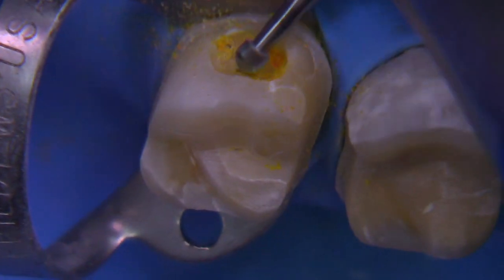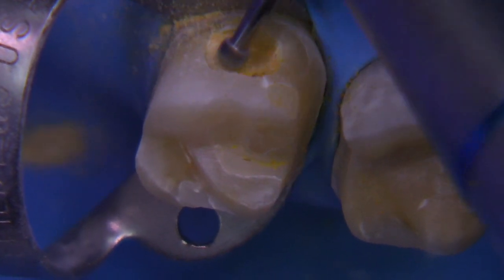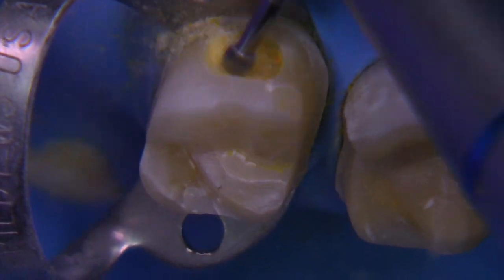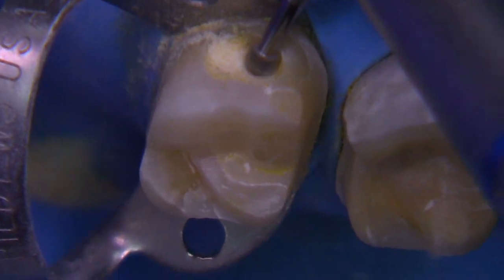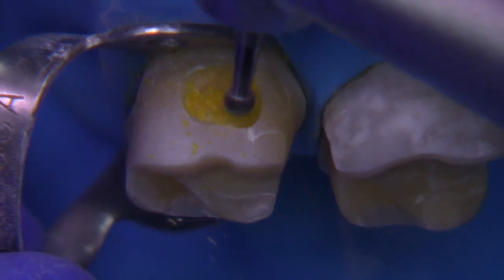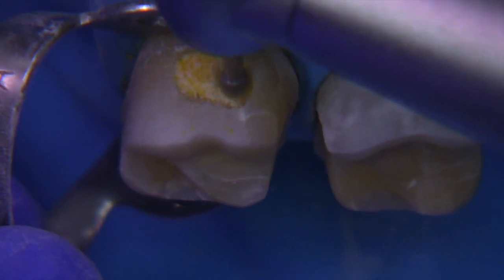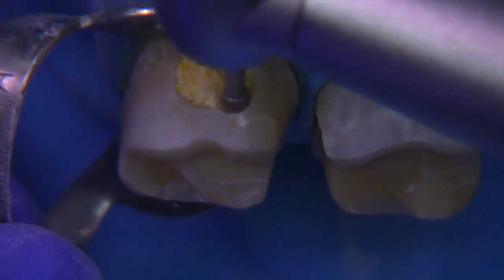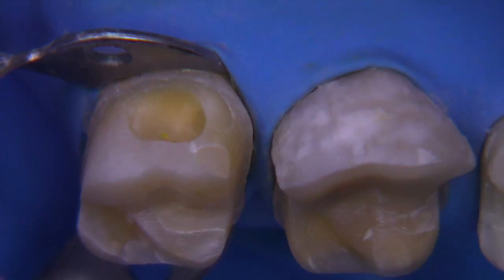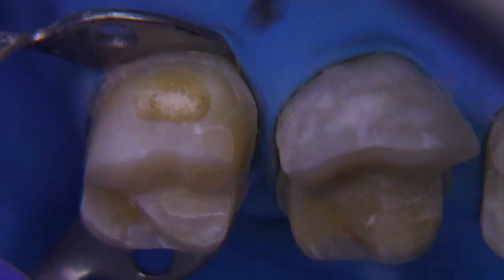Once we get to the point where the periphery is clean, then we move on to the slow speed. If you're going to use an electric handpiece, you probably want to have this going at about 5,000 RPM, or you can go a little slower too. After we remove the caries and get that completely clean — it's rather shallow — we're going to remove all the stain in this particular case. We're going to do the same thing on the lingual with the round burr and make sure everything's totally clean.